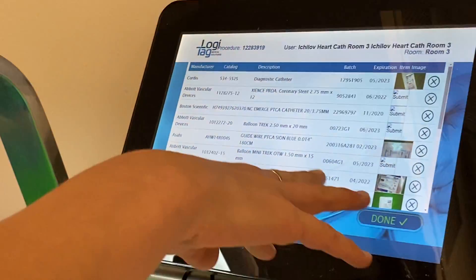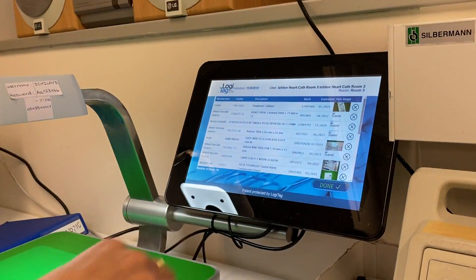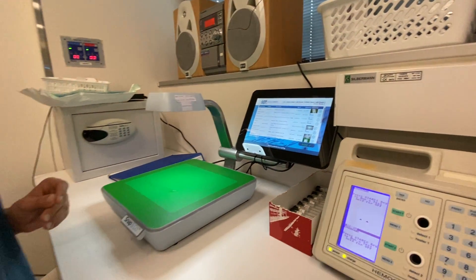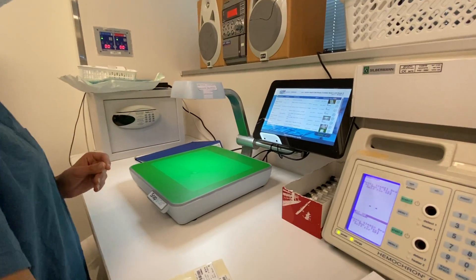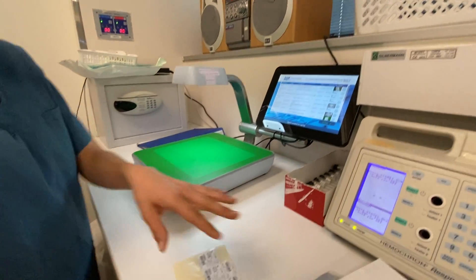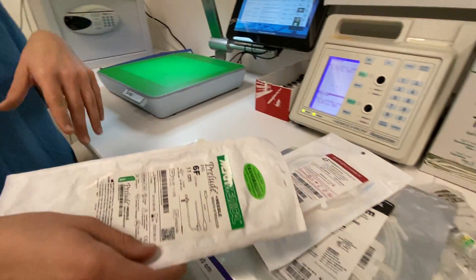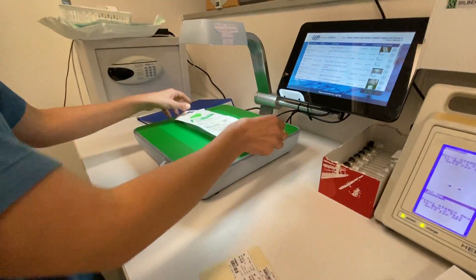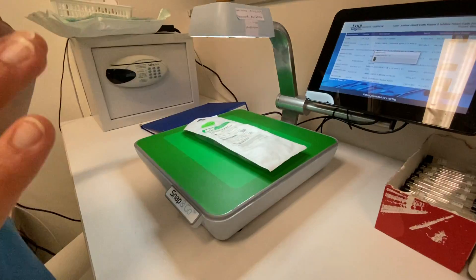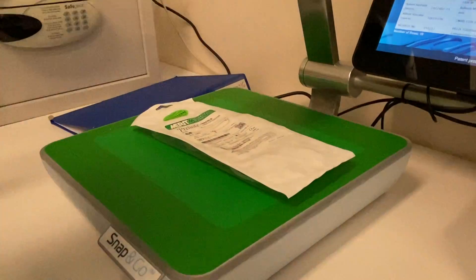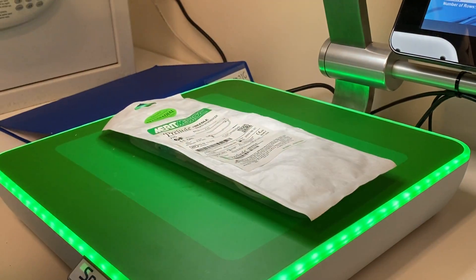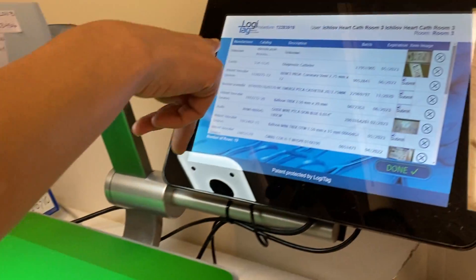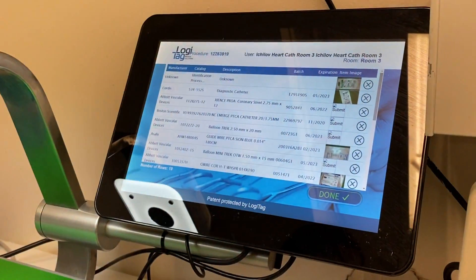Now if I want to scan something, I have four items prepared. Place them on the area, wait for the green light, then remove. I don't wait to see if it's been processed.